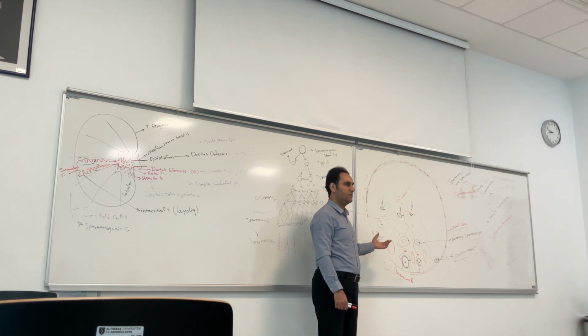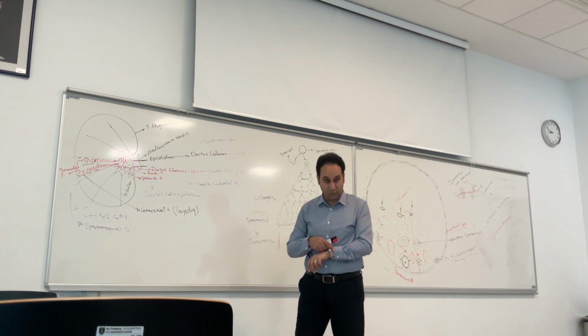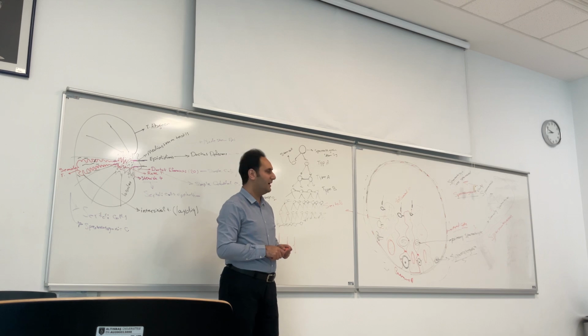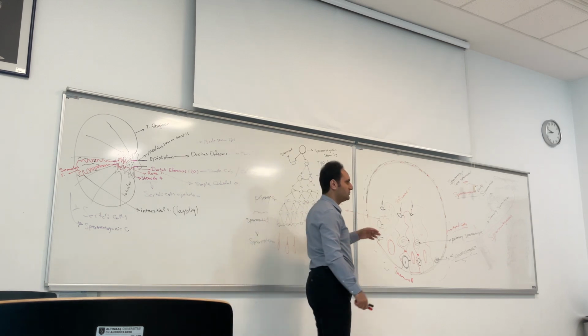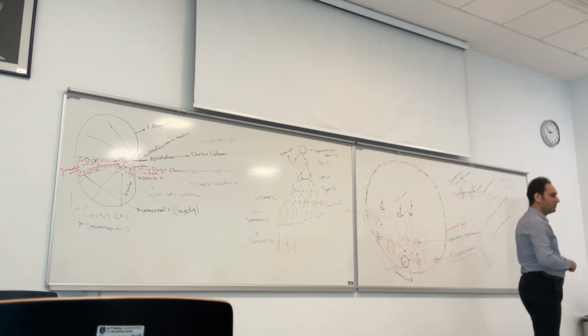Can you understand this part? Do you have questions related to the seminiferous tube and Sertoli cells and stages of the spermatogenesis? In English.